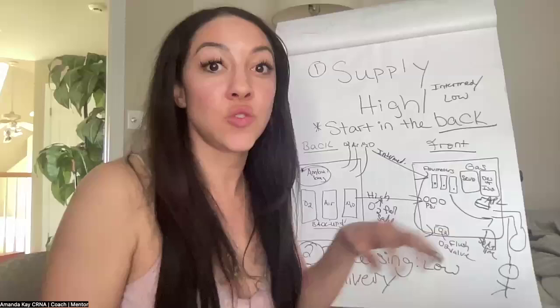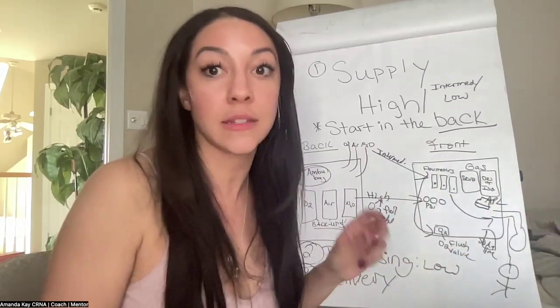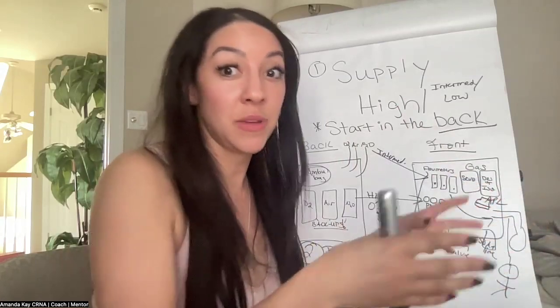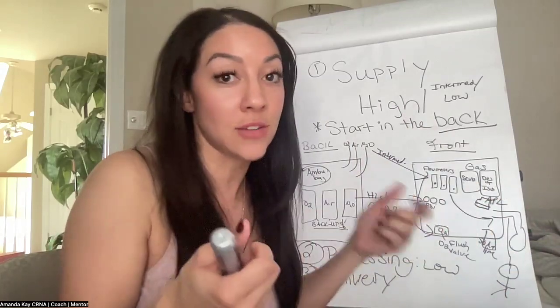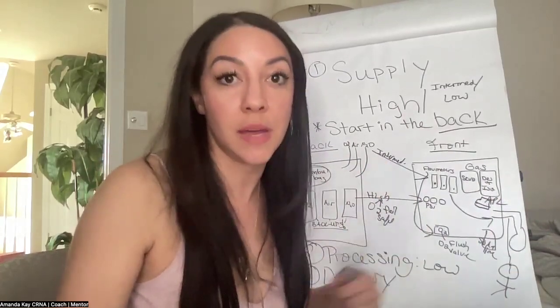I talked about the CO2 absorbers. If there's any issues with your bag valve or vent switching from spontaneous ventilation, where you can use the APL valve, or switching to the vent. Sometimes what houses the bellows with the vents, depending on the machine, can be loose or crooked. That's happened. You could just have leaks in your circuit. I mean, the circuits could get scratched or something like that. Moisture building up in the flow sensors, any of those things.